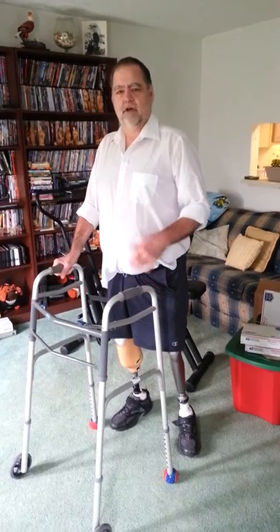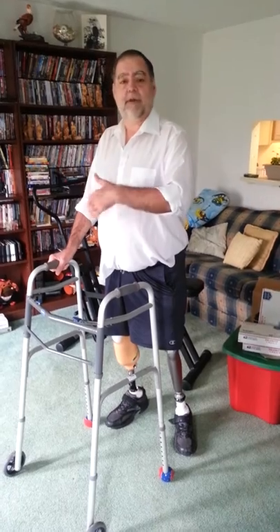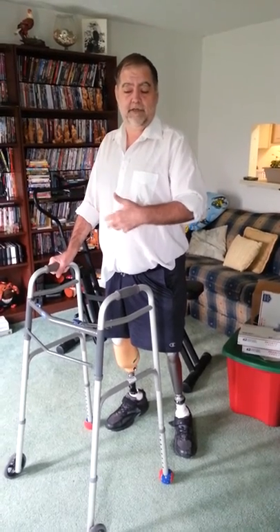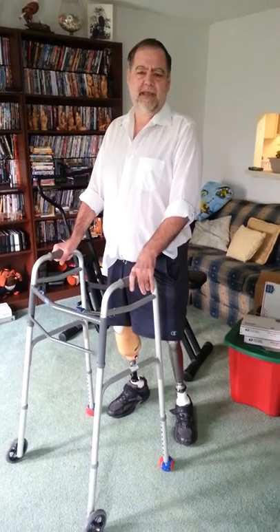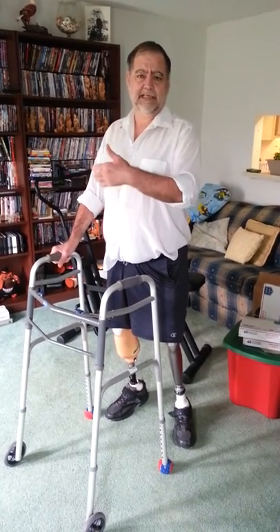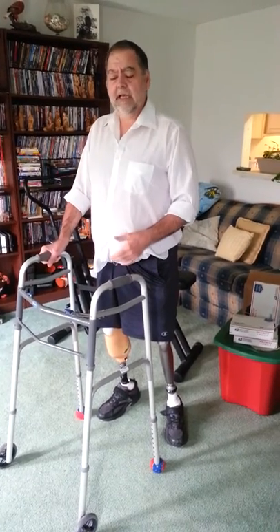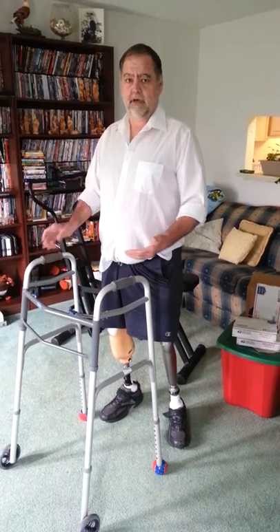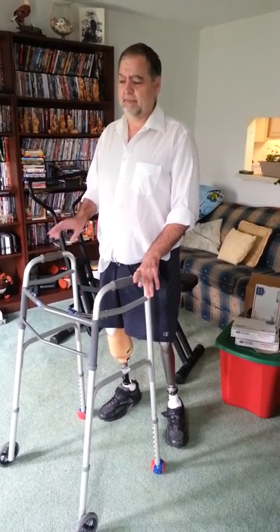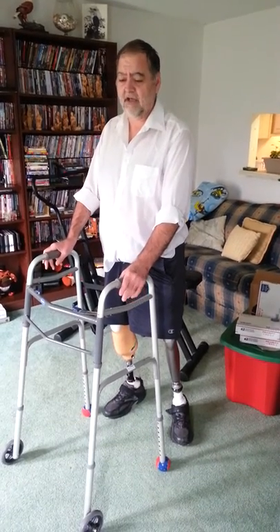When you're starting to rehab, you're in a rehab facility and they have things like parallel bars to train you how to walk. I find that it's really easy to learn to walk in parallel bars. I don't have parallel bars at home, so I had to use a walker at home. I'm suspecting that most people are in the same situation — they're not in a position to install parallel bars anywhere in their house.